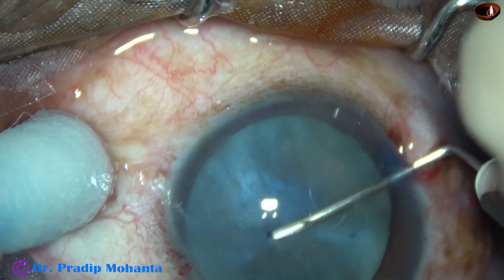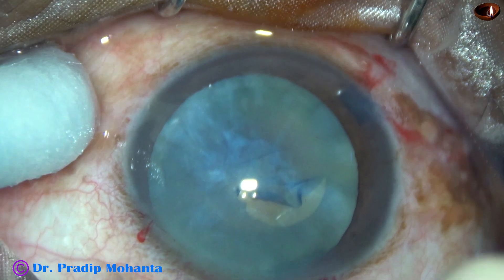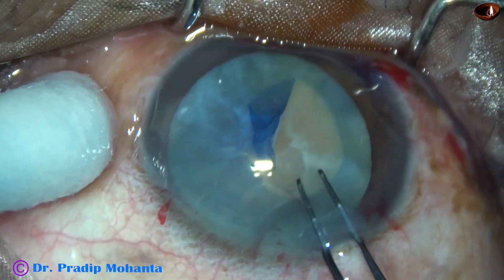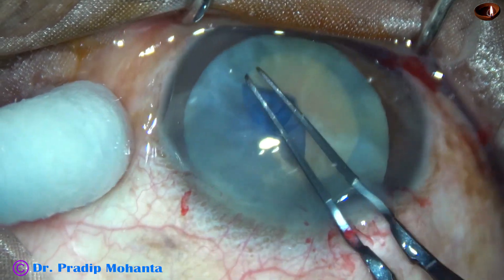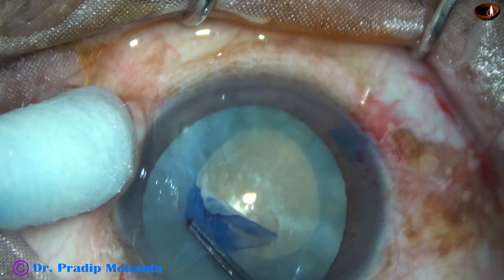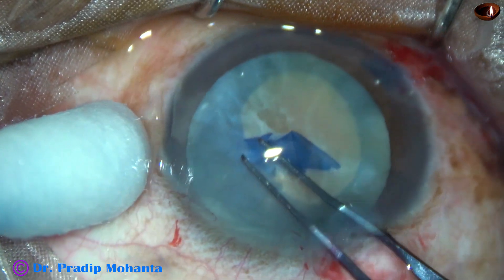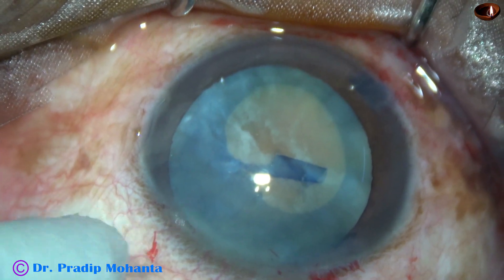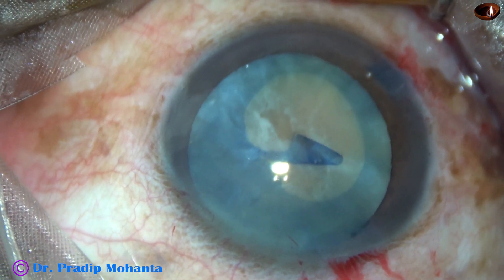I use a cystitome in this case to raise a capsular tag and now I go anticlockwise. As I reach 4 o'clock, I find that the capsule is adherent. I keep intermittent pull and it is a very small rhexis — it is not enough for nucleus management.